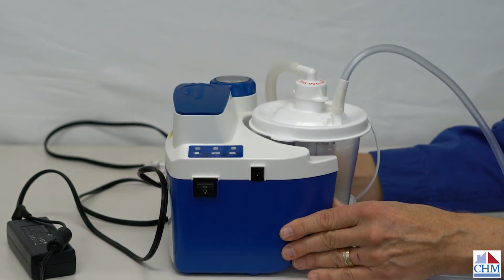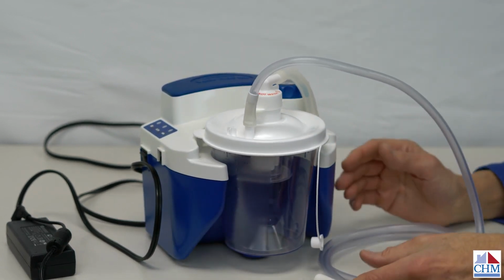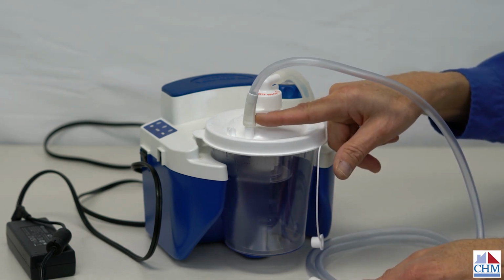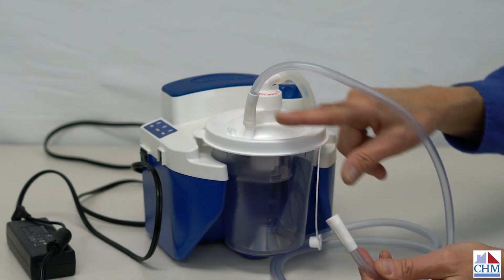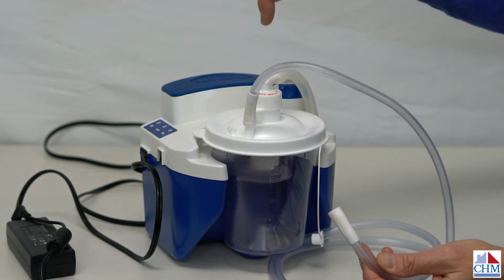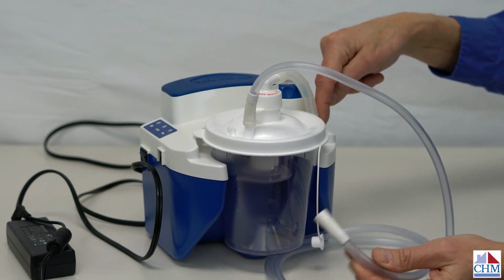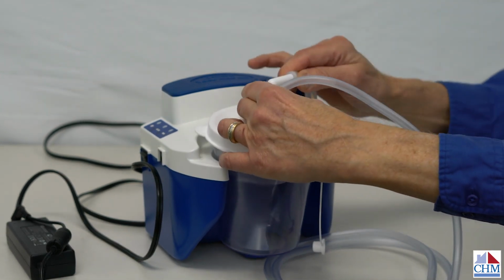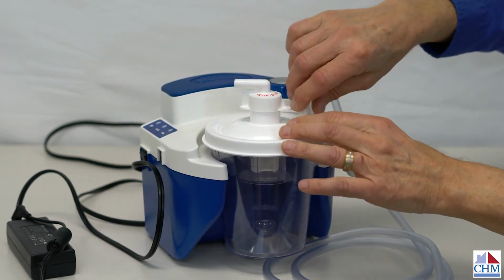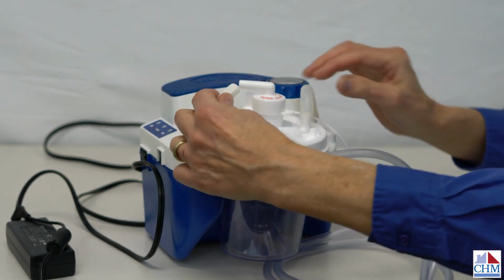I'm going to put this down, and I'm just going to turn the machine this way because I want to show you it can be easy to hook up the machine the wrong way. So always look and make sure that the suction tubing that's going to the patient is connected to the outside of the jar, and the inside, down in the center of the canister, goes to the machine itself. And I just want to show you real quickly that it's easy to do it the wrong way, which is why I suppose it happens sometimes, where you'll get it hooked up this way.